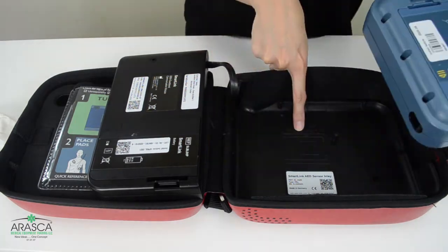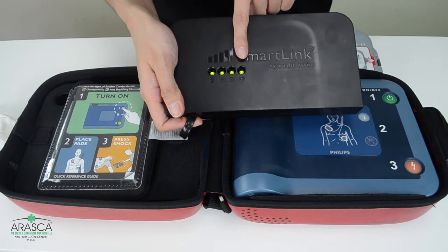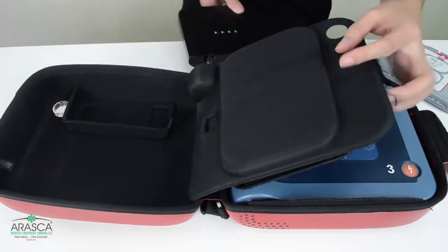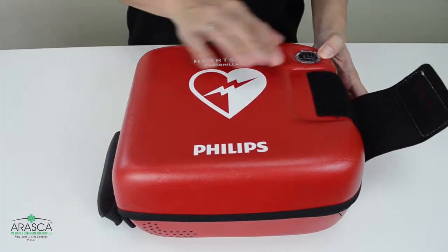Let the AED run its battery self-test and wait until the four green lights of the SmartLink go off. This means that the AED is done connecting to the cloud server. Finally, place the SmartLink inside the case as well as the pads, and your AED is back on track.